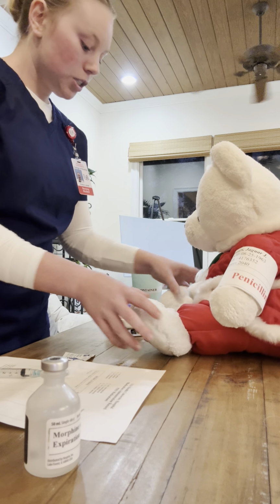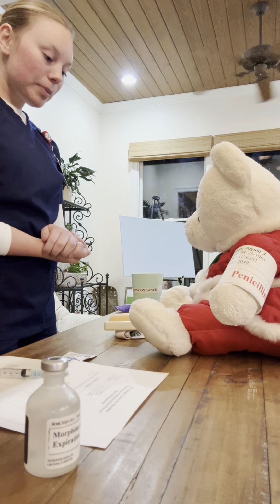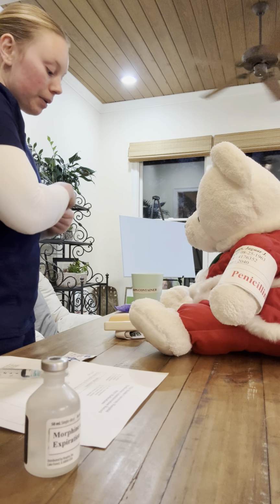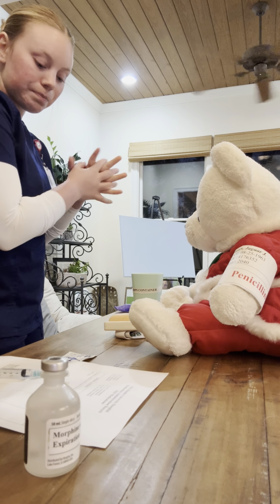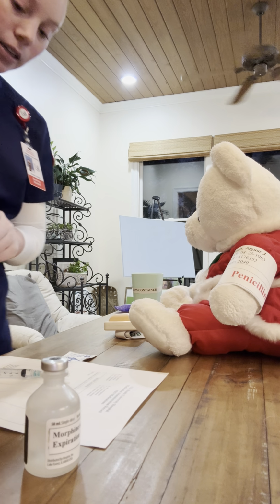Okay. So I would enter the room and I would say, "Hi, Mr. Jones, my name is Kirsten Joyner. I'm a student nurse here at South. I'm going to be giving you your morphine injection today. Is that okay?" All right, well, I'm going to perform my hand hygiene. And before we get started, I'm just going to perform the 7 rights and make sure everything's looking good, okay?